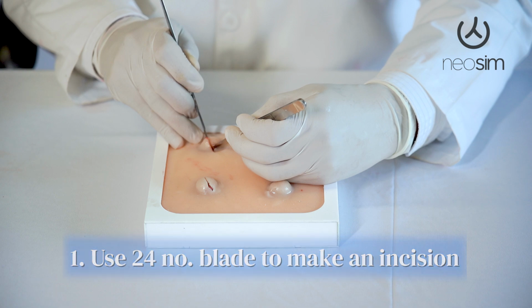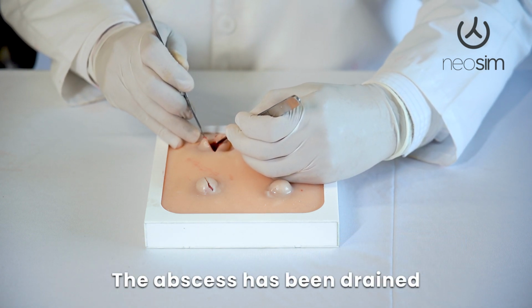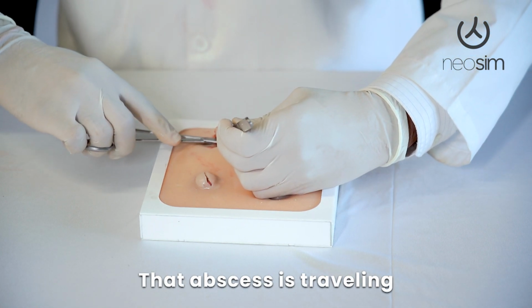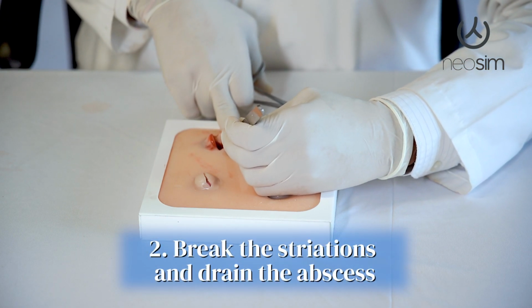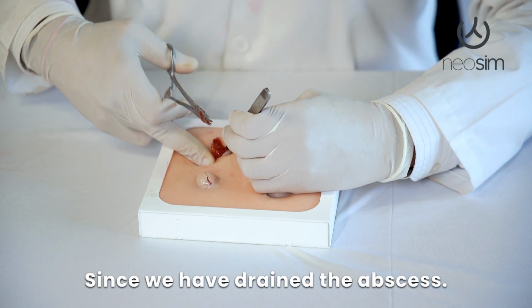Now I will show you the procedure where we will be using a number 24 blade to make an incision over the abscess, and you can see the abscess coming out. The abscess has been drained, and I can see the striations, where the abscess is traveling through the tissues into the spaces. Those striations have to be broken, and it has to be drained out. We can see the abscess coming out since we have drained it.